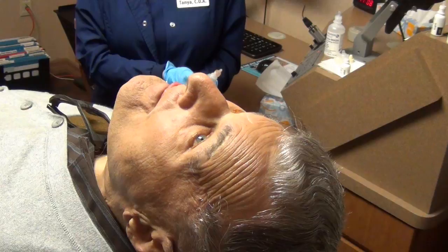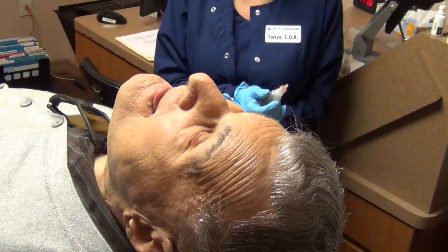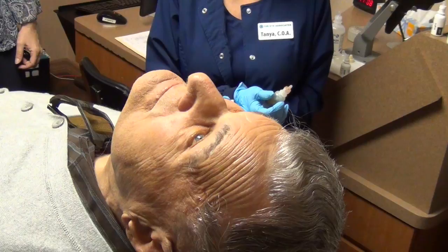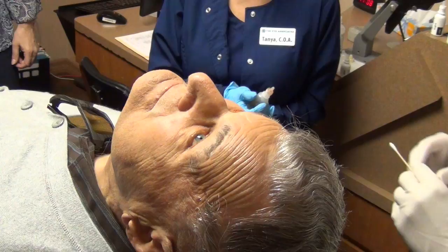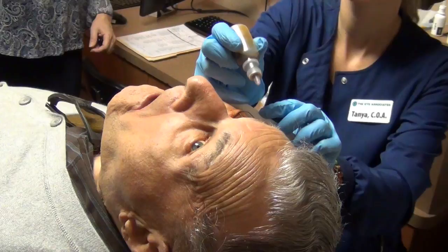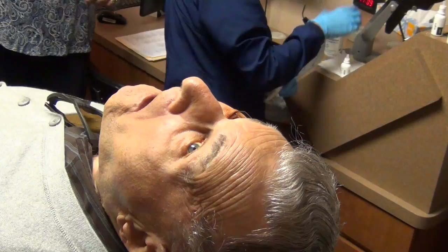It's really important — before we pull off the needle, we want to make sure that no one talks, so we minimize the risk of any sort of infection. Here comes that clip — we put the clip right in the eye. Robert is a pro, he does this perfectly. Look up and to the left, and then we put a few drops of betadine right where we're going to do the injection to clean the ocular surface and make sure the eye is nice and clean — let that sit and kill all the bacteria.